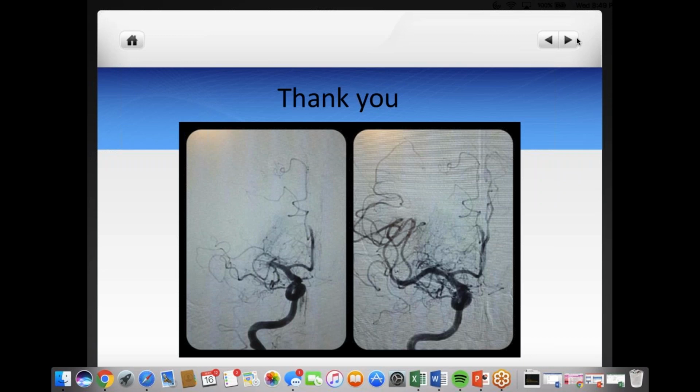So I think MRI is a very important tool, let's put it this way, and can play a fundamental role in determining whether a patient will go to intervention or not. Why so? Because if you have a patient that comes with a very high stroke scale, let's say the typical right-sided hemiparesis and aphasia, and you don't want to do a CTA because the patient's allergic to contrast, and you do an MRI and you see a large DWI lesion, then probably you want to stay away from that patient.